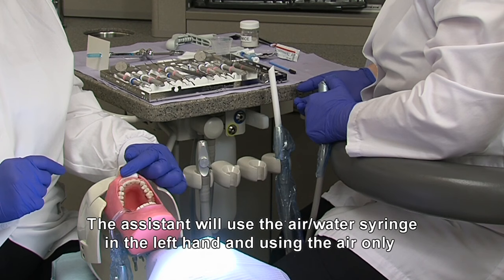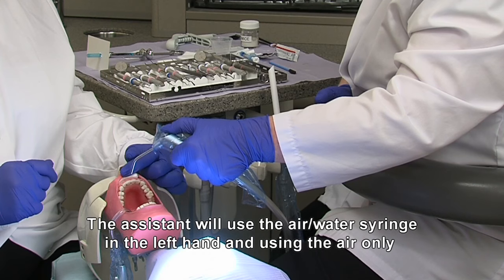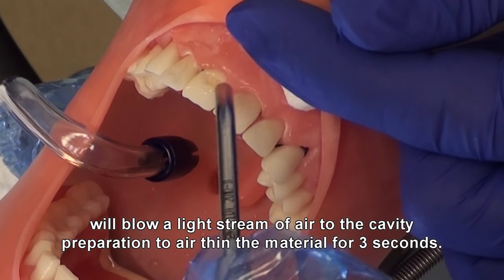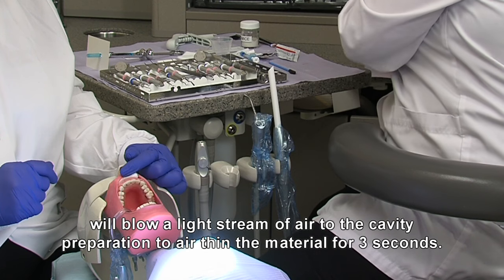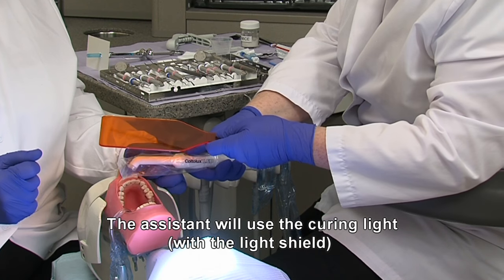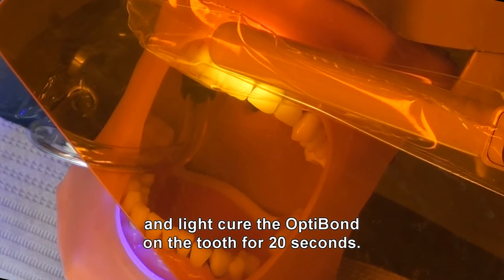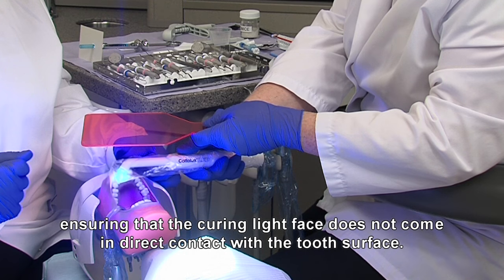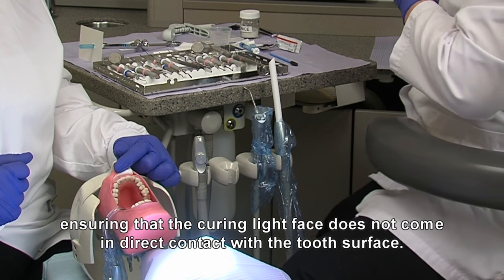The assistant will use the air-water syringe in the left hand, and using the air only will blow a light stream of air to the cavity preparation to air thin the material for 3 seconds. The assistant will use the curing light with the light shield and light cure the OptiBond on the tooth for 20 seconds, ensuring that the curing light face does not come into direct contact with the tooth surface.